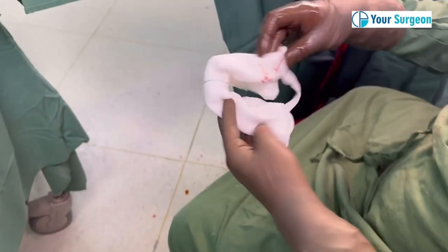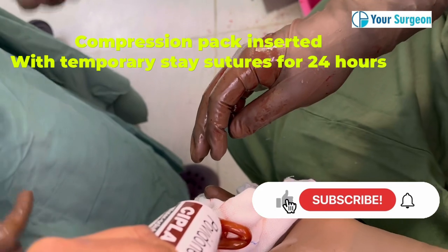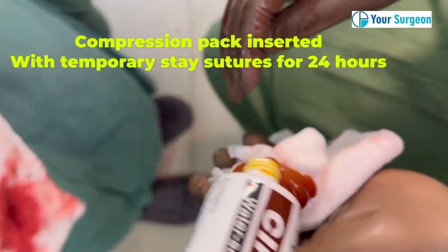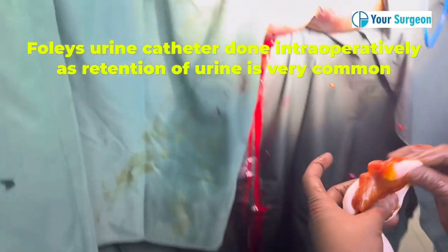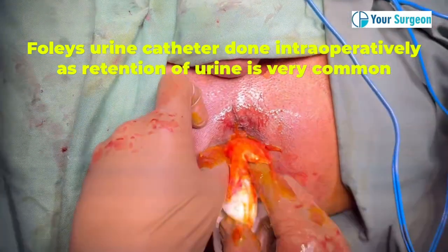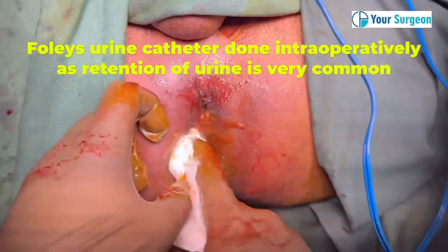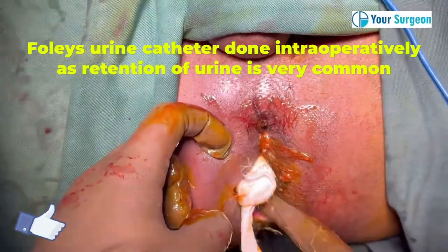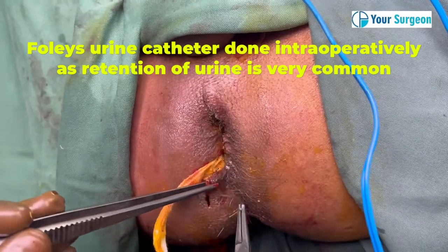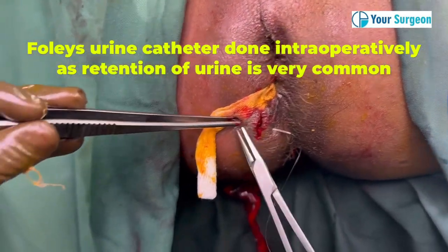Since these huge abscesses always have a bleeding tendency, we are using a povidone-iodine-soaked compression pack, as seen in this video. This compression pack is kept in the abscess cavity for 24 hours, and stay sutures are taken after placement. Make sure the compression tail is left outside to avoid losing the pack in situ. Temporary stay sutures are then taken, which will be removed after 24 hours to ensure good hemostasis and avoid profuse bleeding.